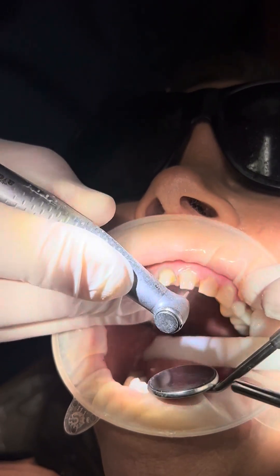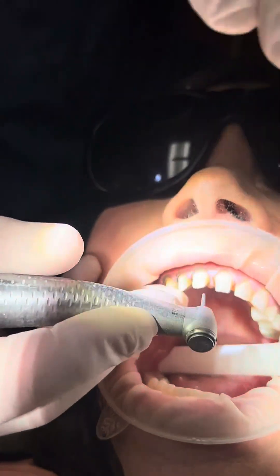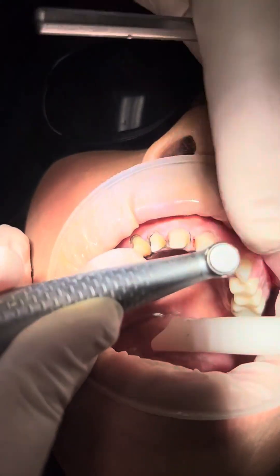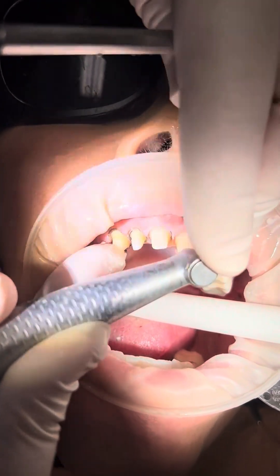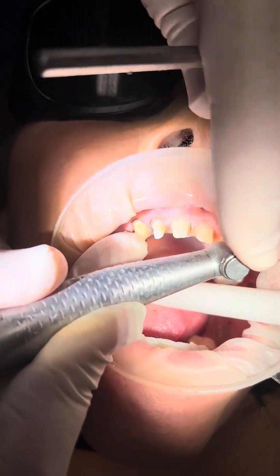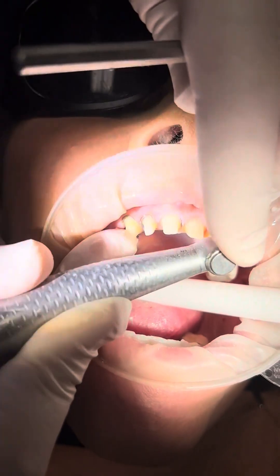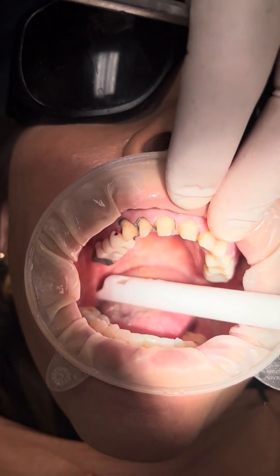I now have my preliminary margin and I'm looking for the 360. The next thing I'm going to do is take the bur at a 45-degree angle and make a little bit of reduction all the way to the lingual at about a 45-degree angle. This is very important — so many times this step is not done, but it's a 45-degree reduction.